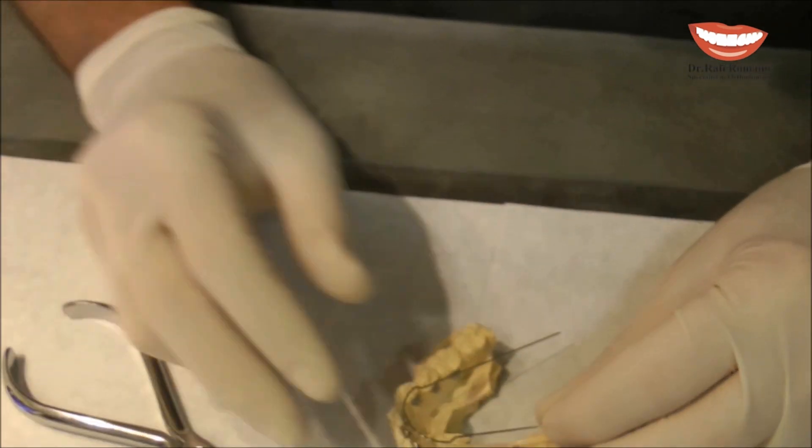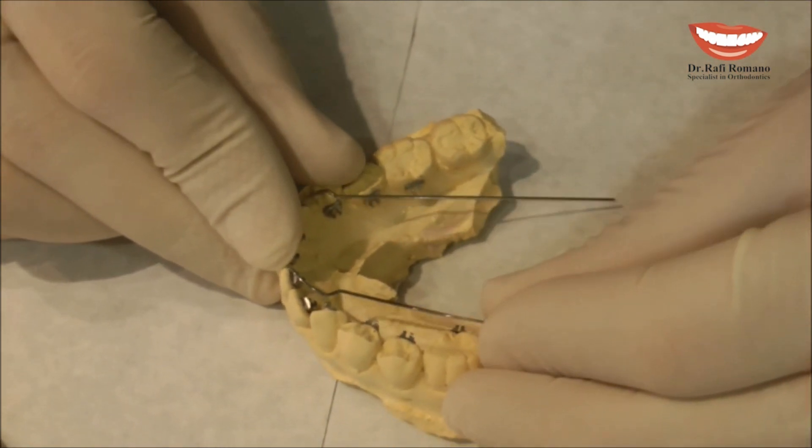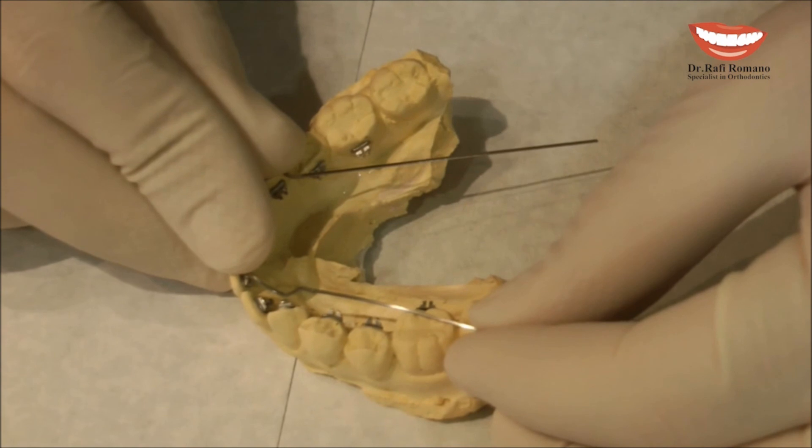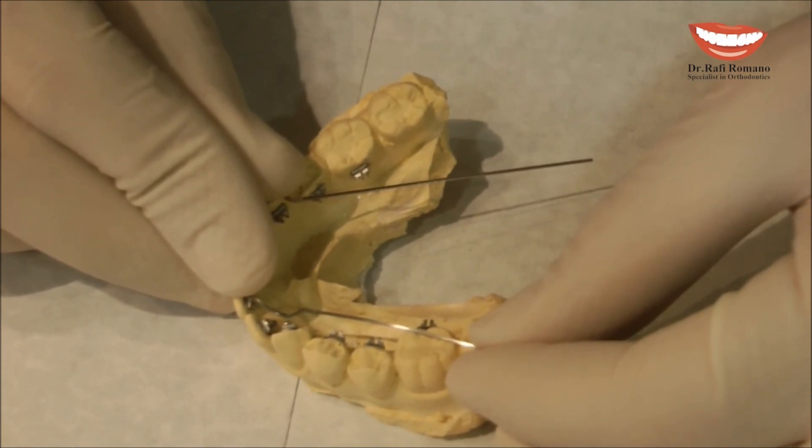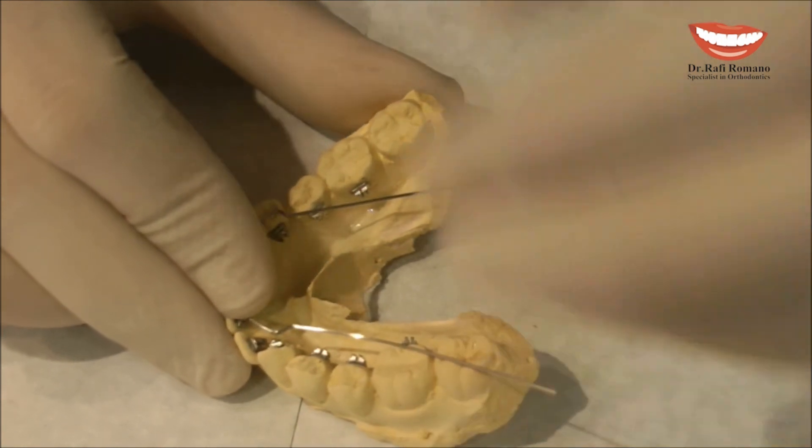So now you will be able to see the effect of this band on the arch. The molar will get some anti-rotation movement.